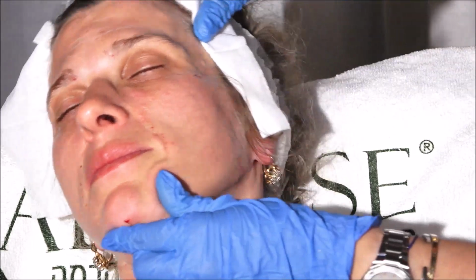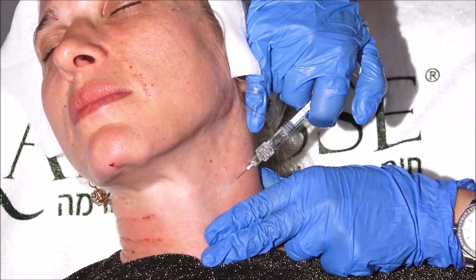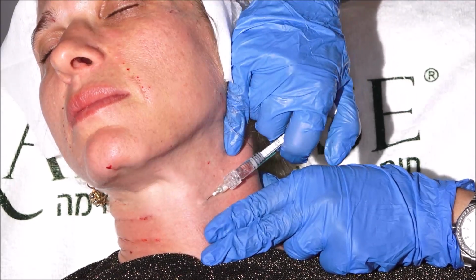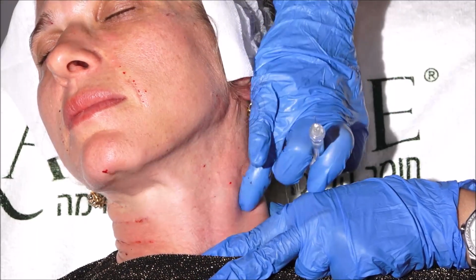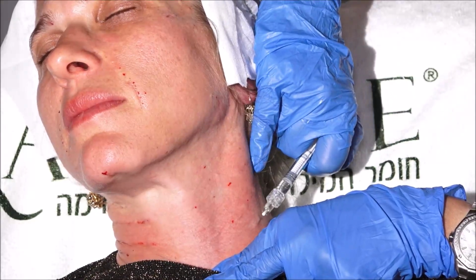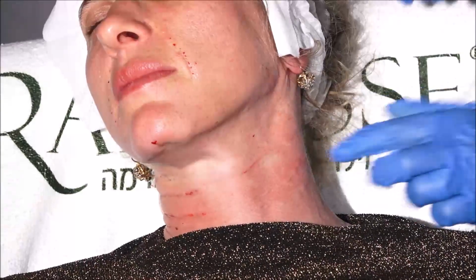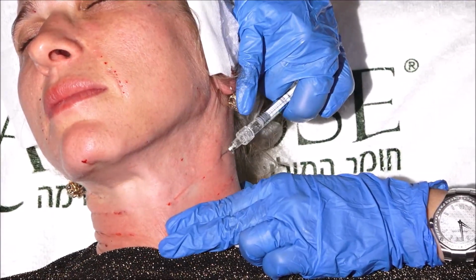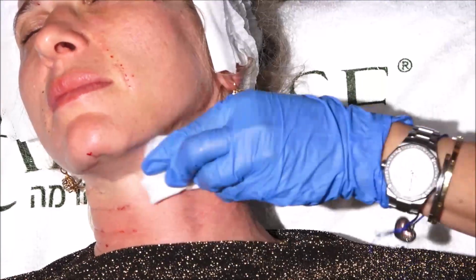Here, and then the Revive. Last one, it's this one, yeah. I changed the... Thank you. That's it. That's it.